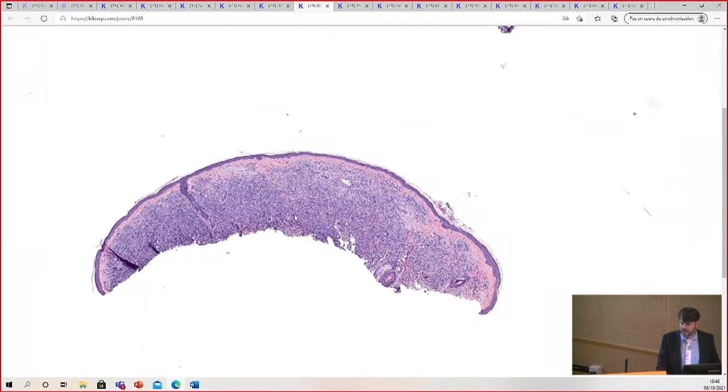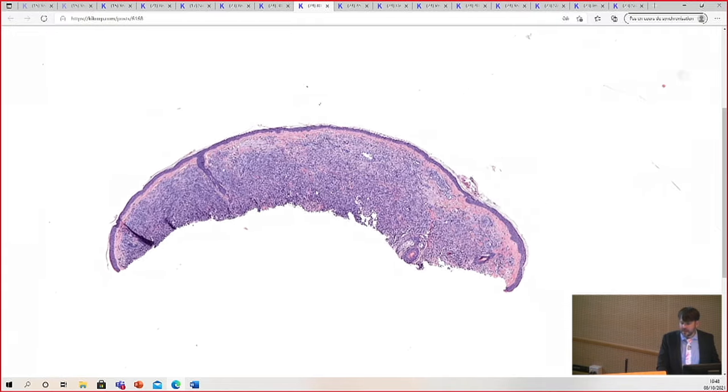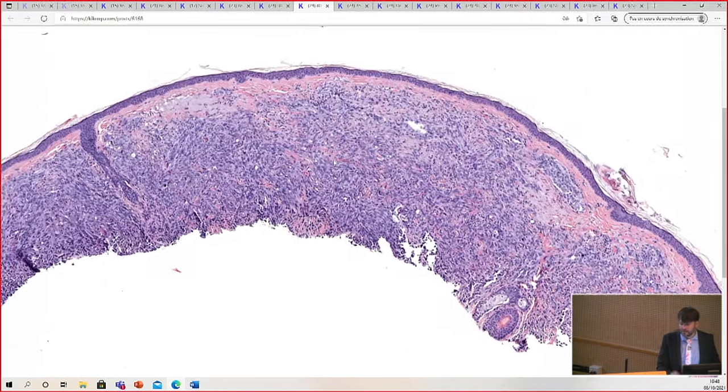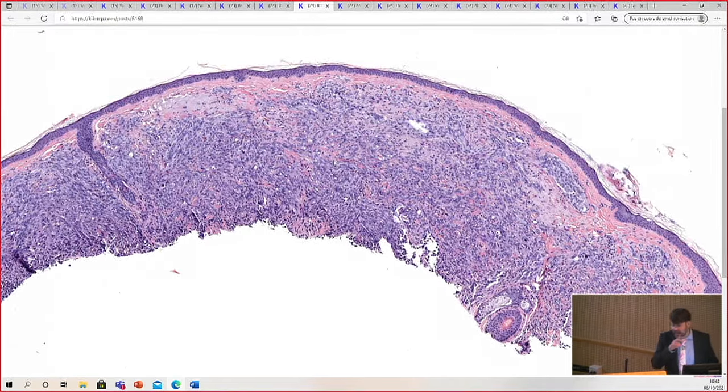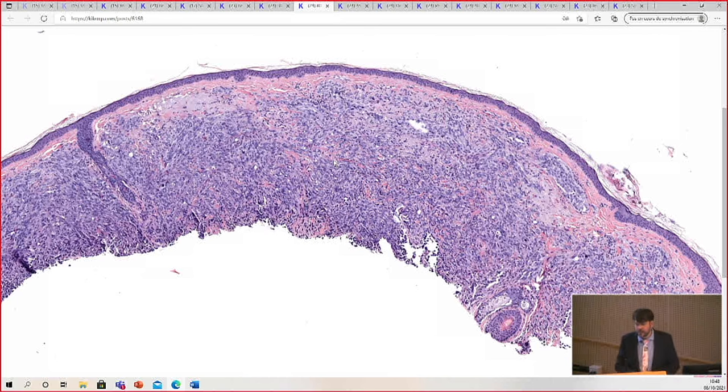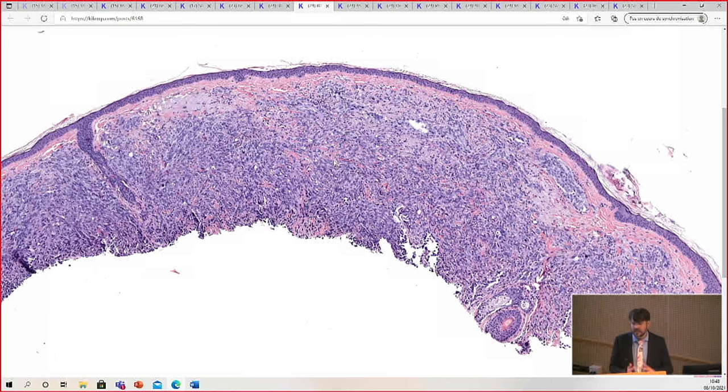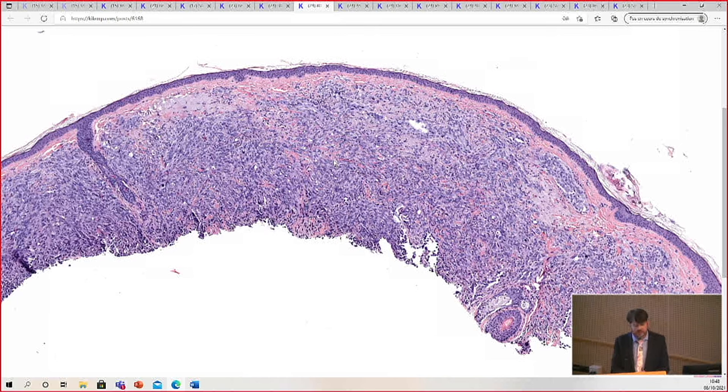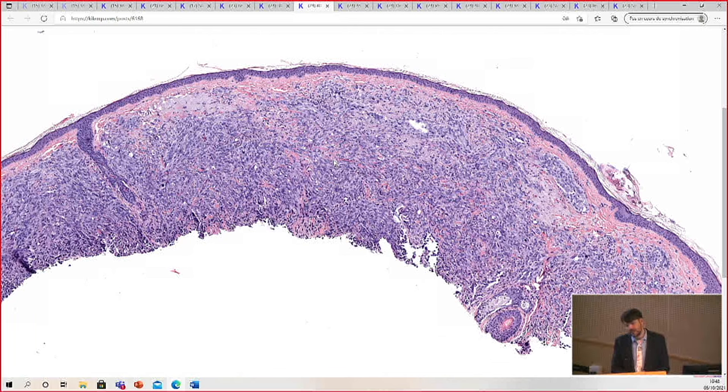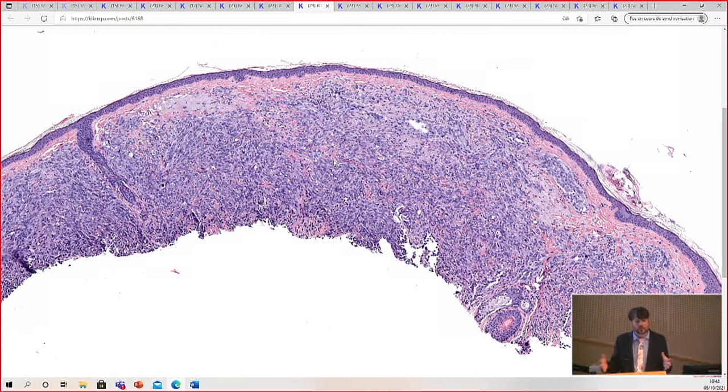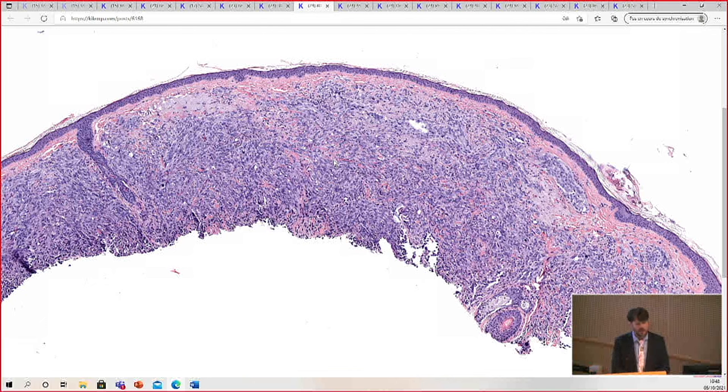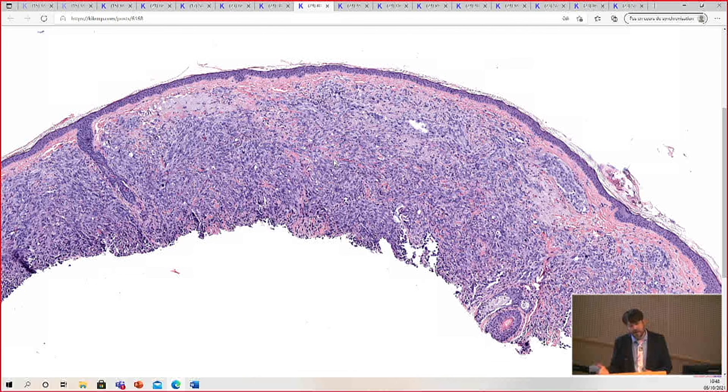My colleague had done S100 protein or SOX10, one of those. CD34 was negative, S100 was negative, desmin was negative, P40 was negative. So we've done the usual panel of markers you might consider for ruling out, for looking at atypical fibroxanthoma versus melanoma versus spindle cell squamous cell carcinoma.